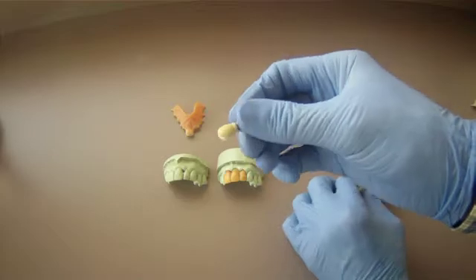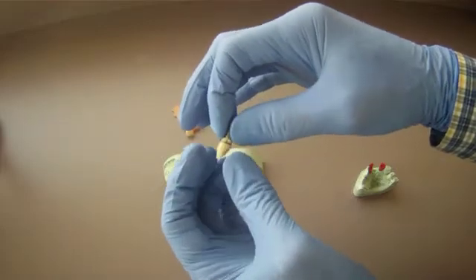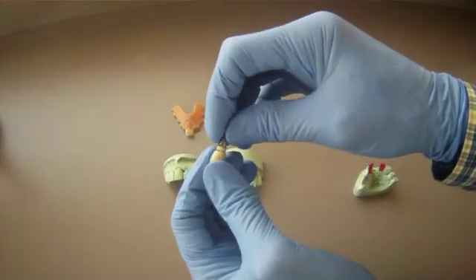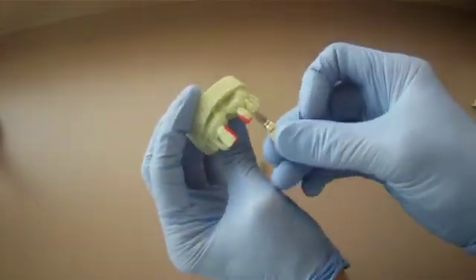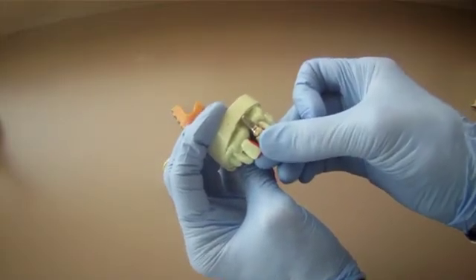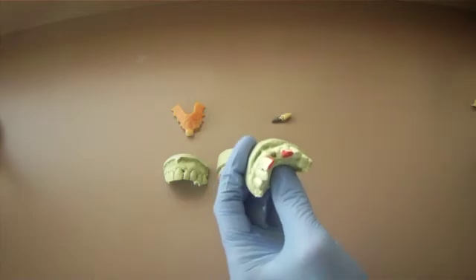Now the difficulty with these devices is it's made of titanium. It's a screw post. It has a chromium nickel sleeve and another metal, so 3 types of metals that can cause a tremendous amount of galvanism or corrosion. And the body will often reject this kind of a system because the body treats it as a foreign body reaction. And quite often they will loosen and eventually come out easily. I don't advocate these at all. There are some other reasons for that.